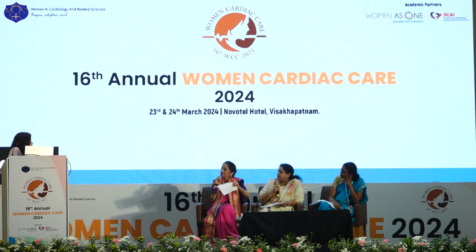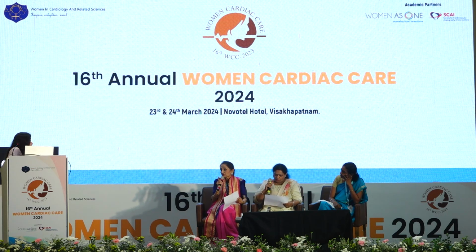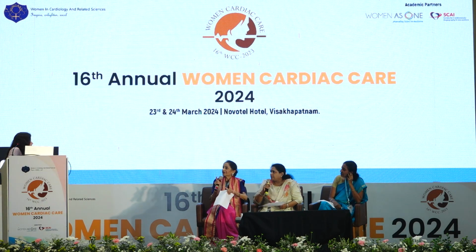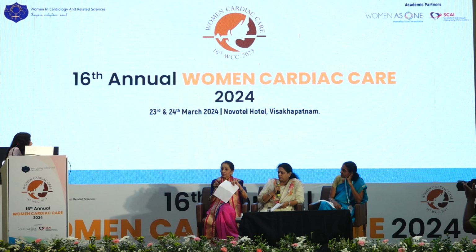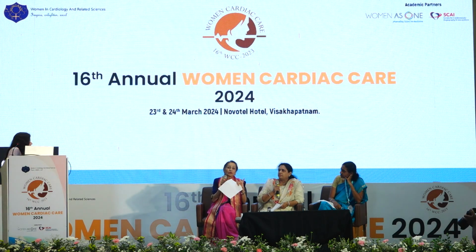In myocardial bridge, the stent fractures over a period because of the shearing effect. But here it happened immediately. Yes, that is because of the fibrosis. So whenever you see an ostial stenosis, it is mandatory for you to rule out the other conditions. In your case, it was not difficult because she already had paralysis and everything. But when patients come with heart failure or with ostial stenosis, please look for Takayasu arteritis, especially in young women. That's a message from your case.